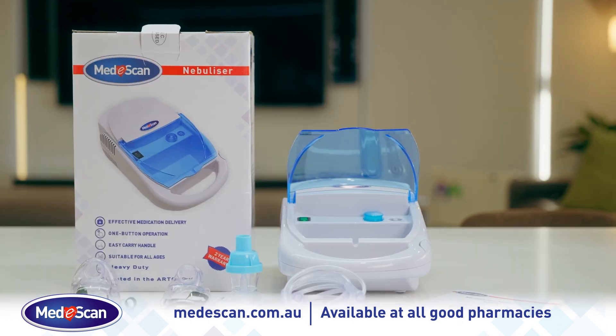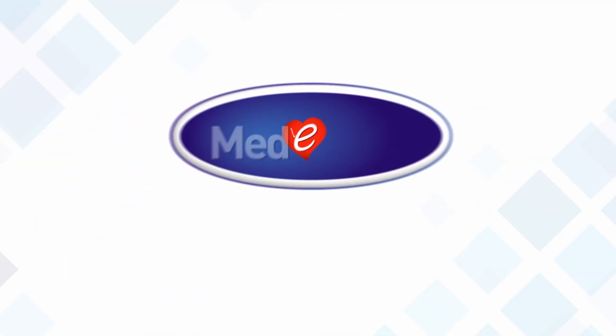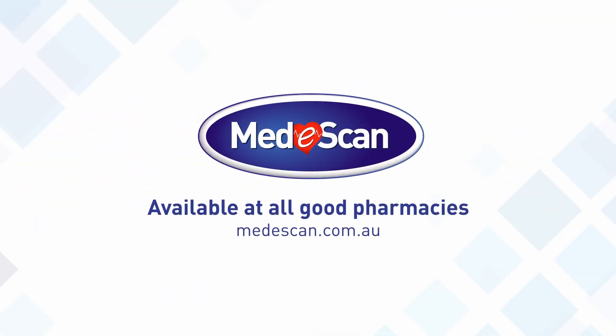The MedeScan nebuliser is easy to clean and lightweight, making it an ideal choice for everyday use. Available at all good pharmacies and medescan.com.au.